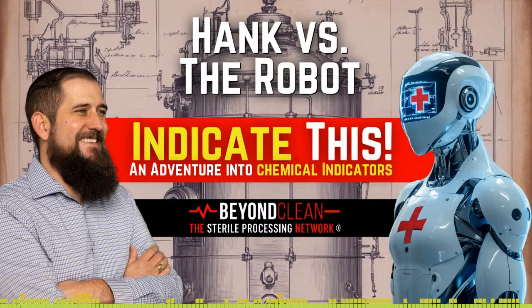Chemical indicators and integrators are a piece of the sterility assurance puzzle, but they don't work in isolation. They play a specific role in the context of biological indicators and mechanical or parametric monitoring. Let's zoom out and connect the dots. Chemical indicators and integrators provide quick, on-the-spot verification that sterilization parameters were met. Indicators confirm exposure to conditions, like steam or heat, while integrators go a step further by simulating sterilization conditions to approximate sterility assurance. Strengths: immediate feedback, useful for everyday load checks.